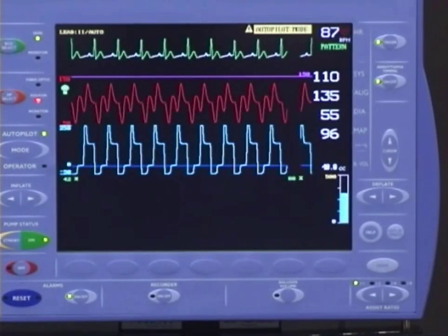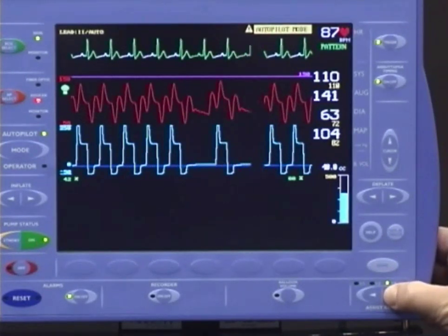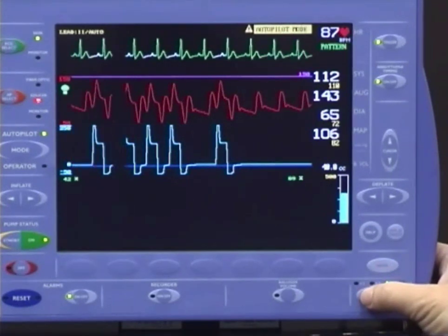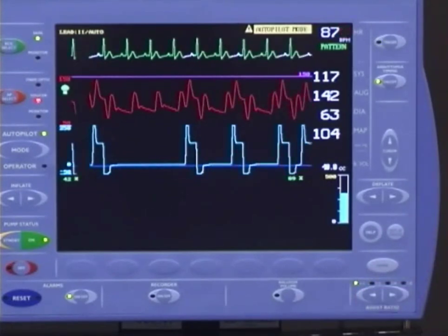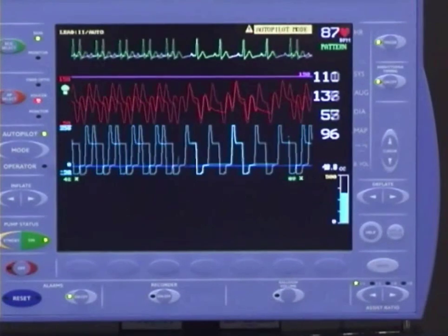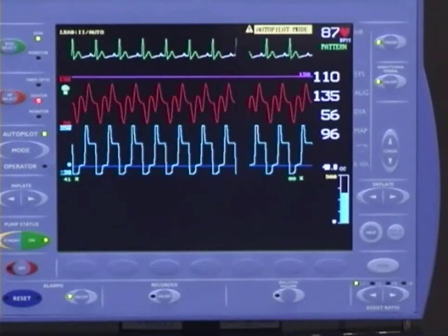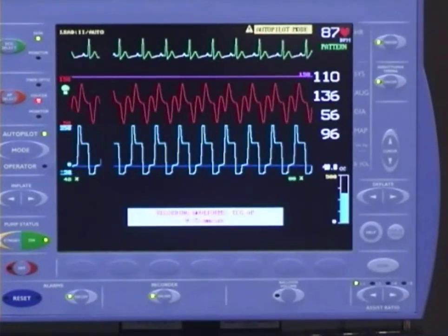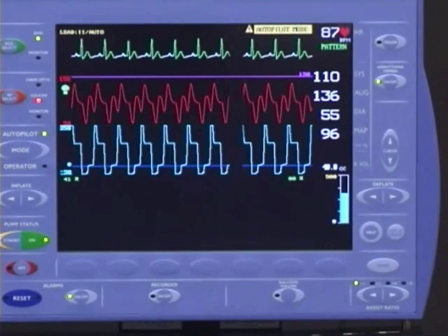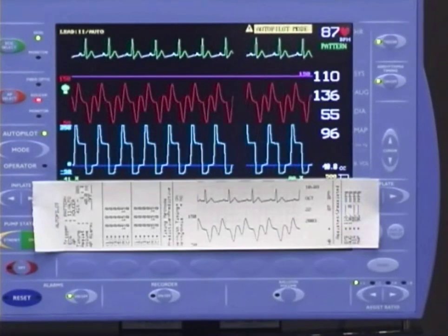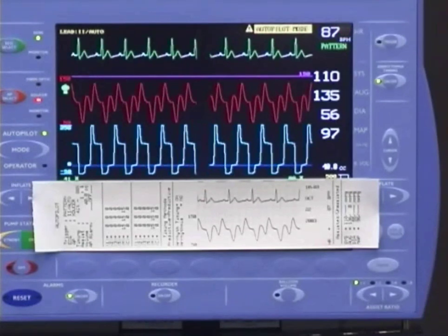The assist ratio key is located in the lower right-hand corner of the keypad. You can change the assist ratio in either direction. You may wish to run a strip chart recording for documentation. To start printing, press the recorder on-off key. When the strip is of sufficient length, press the recorder on-off key again to stop the printing. At the beginning of the strip, you will find pump status information, followed by the selected waveforms, then the date, time, and hemodynamic information.